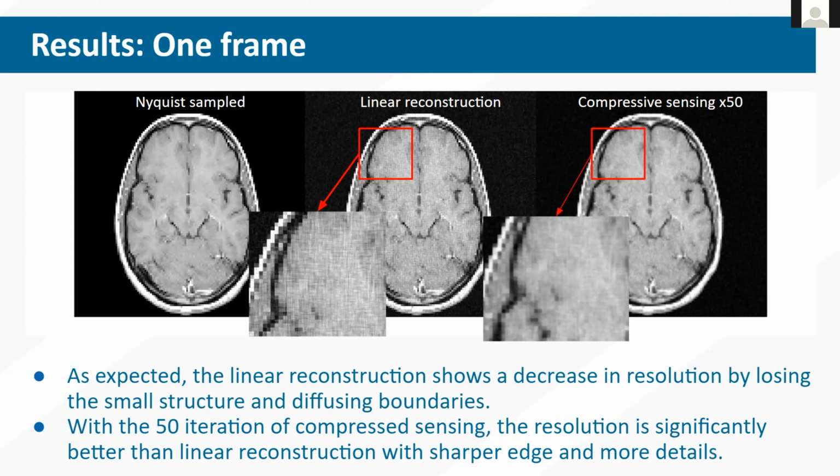Yes, and also for this slide, when we construct this image, the undersample ratio is 1:3, and by using that incoherent k-space undersampling method, most of the information can still be preserved for the image. Okay, I'm just surprised there's not more artifacts there. Yes, because we didn't fully randomize that undersampling. We still have the probability density function to control it from behind.